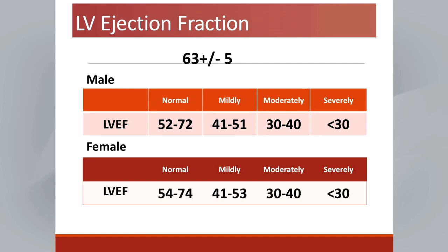Another thing that is new in these guidelines is that the ejection fractions are different between males and females. Women are, of course, superior and have higher ejection fractions than males. This is also something that should be taken into consideration. So we are talking about gender differences, and the numbers are slightly lower than the numbers that were previously reported.